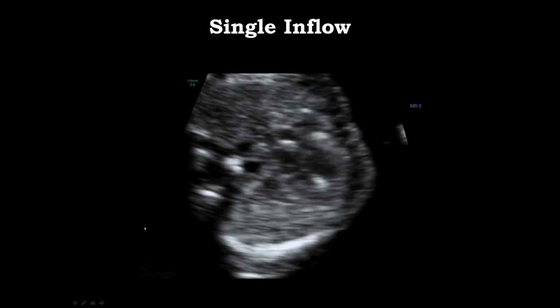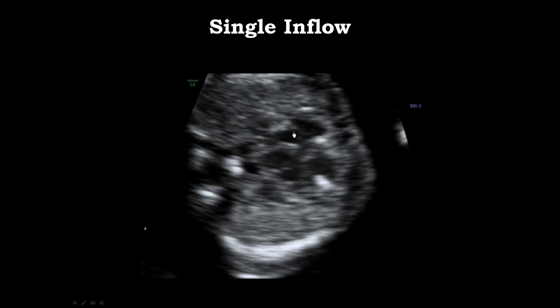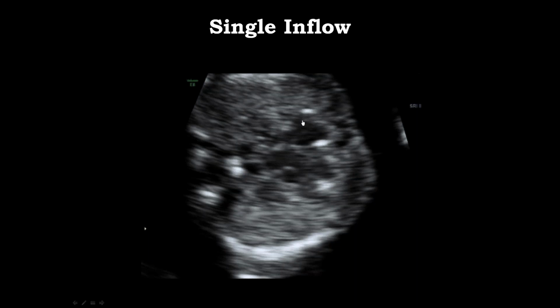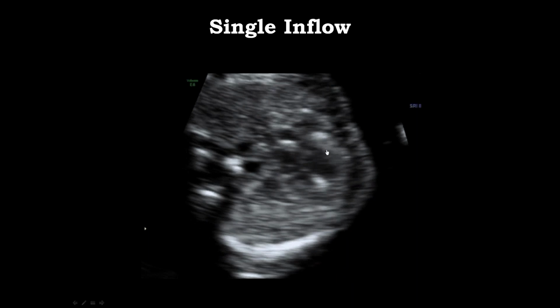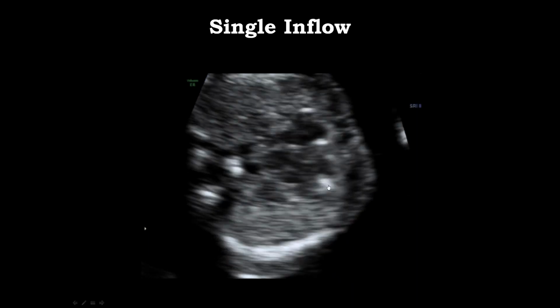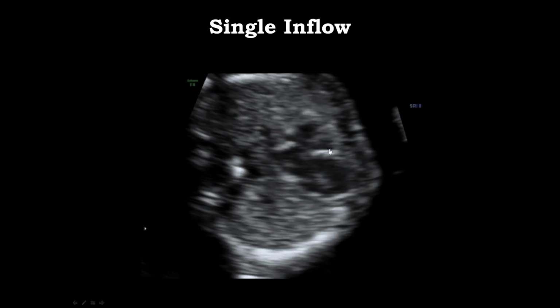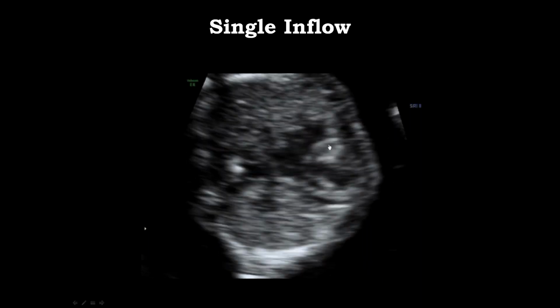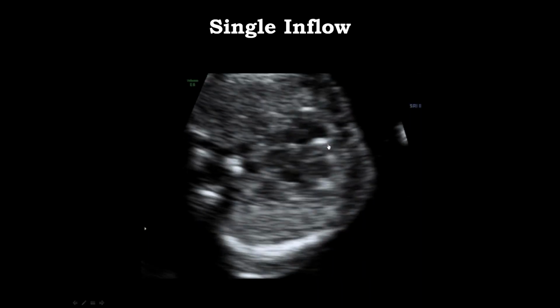This is a situation where we can't identify the interventricular septum, and the cardiac axis cannot be measured. If we look at this case very carefully, we can see the right atrium, the left atrium, and then we have just one single ventricle here. And in this case, this is just a large intracardiac echogenic focus. These are just the subvalvular structures of this valve, which are very echogenic. And this is a situation of tricuspid atresia. We have a teeny tiny rudimentary right ventricle on the side, which, without specific knowledge and a very careful look, is probably impossible to recognize.